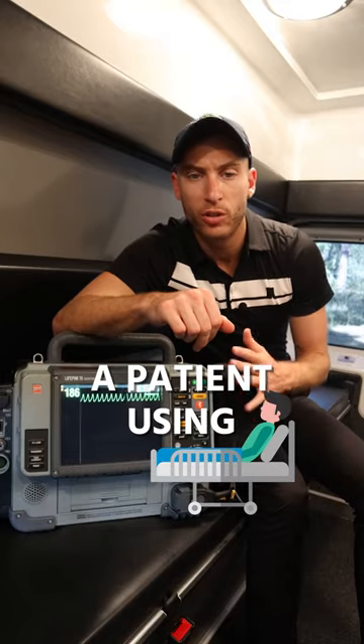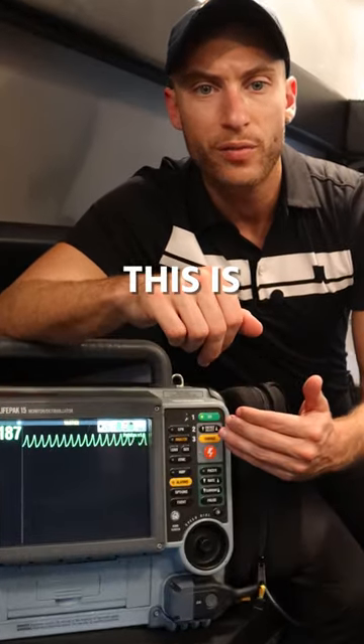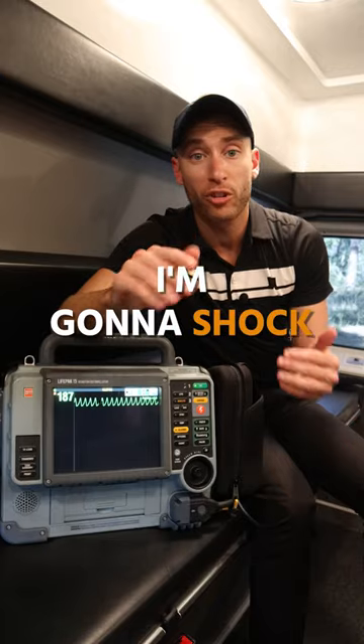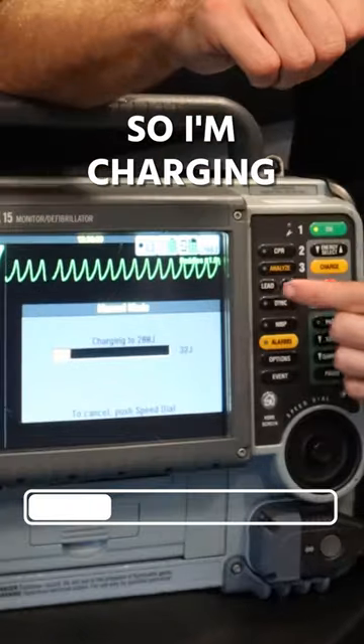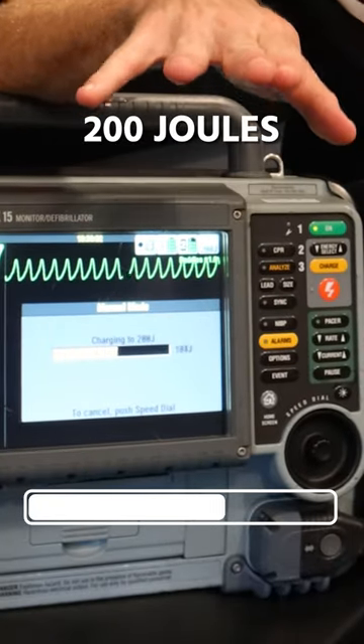This is how we shock a patient using the heart monitor. This is VTAC, a lethal heart rhythm. If I'm going to shock it and this patient is in cardiac arrest, I'm first going to go here to charge. So I'm charging the monitor here — 200 joules.